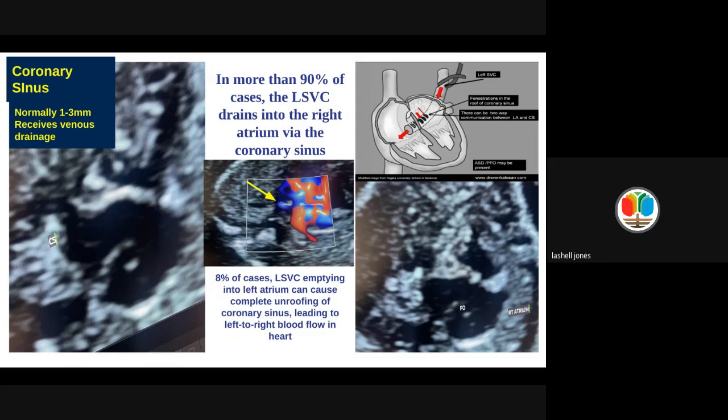Now remember, the foramen ovale, which is in this area, is what causes the right to left shunt. But when you have that increased drainage coming from the coronary sinus, it causes the left to right shunt of blood flow. And so you notice, you see my foramen flap? My foramen flap is now pushed over onto the right side. You can see that in this example.